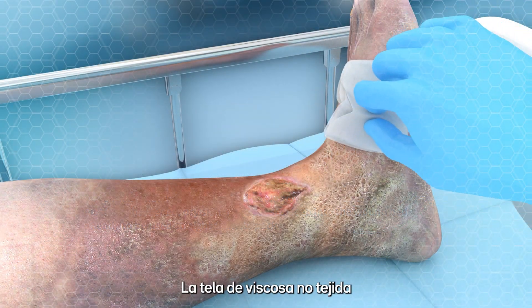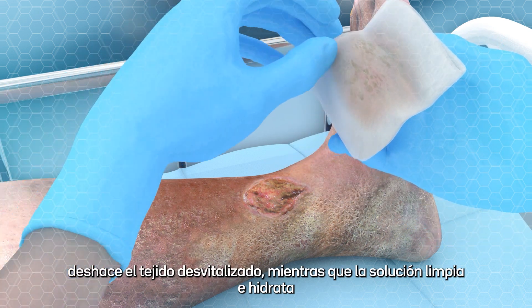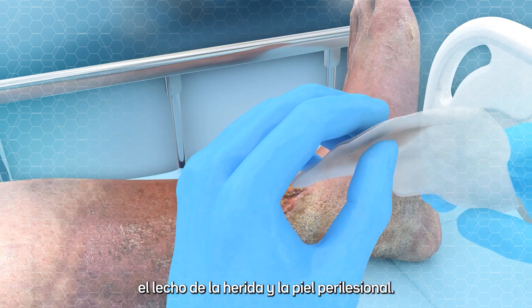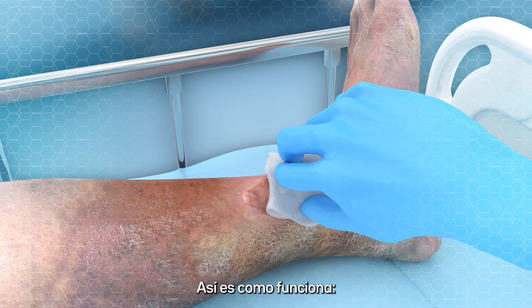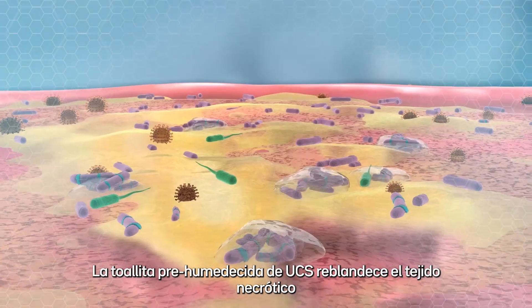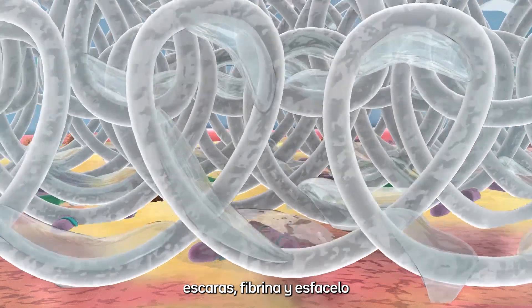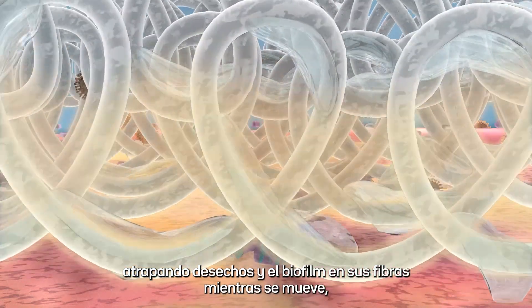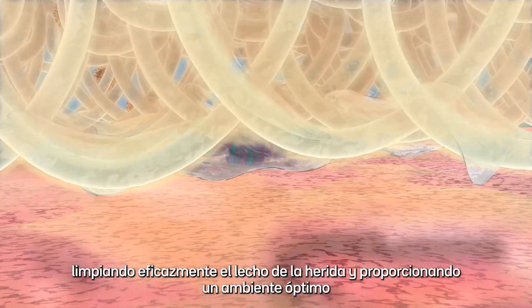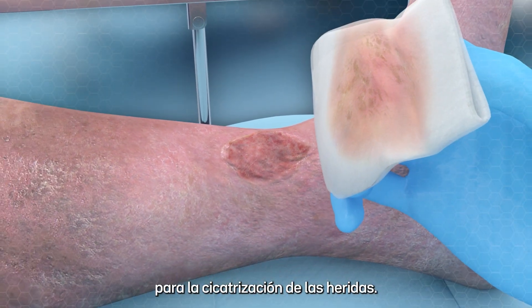The non-woven viscose cloth is effective in debriding wounds whilst the solution cleans and hydrates the wound bed and the perilesional area. Here's how it works. The UCS pre-moistened cloth softens necrotic tissue, plaque, fibrin and slough, trapping debris and biofilm in its fibers as it moves, effectively cleaning the wound bed and providing a healthy environment for the wound to heal.